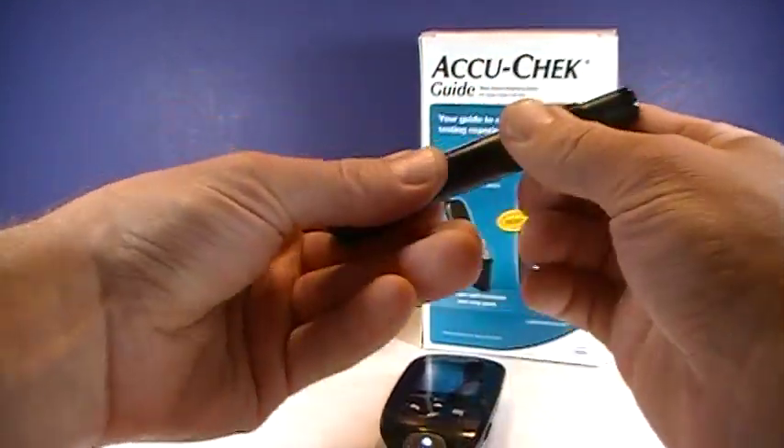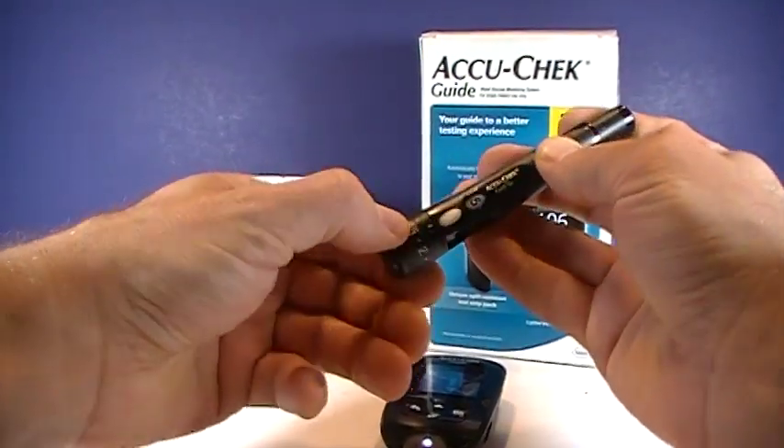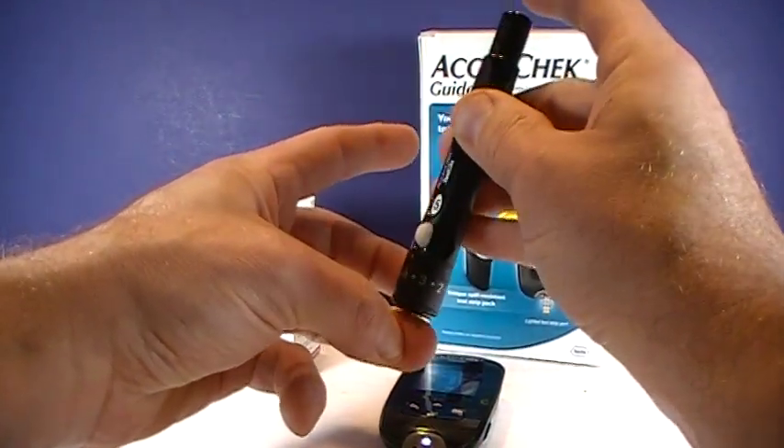Right there is where the lancet comes out, so you can adjust the depth. They recommend starting around two and then adjusting from there — I find four usually works.